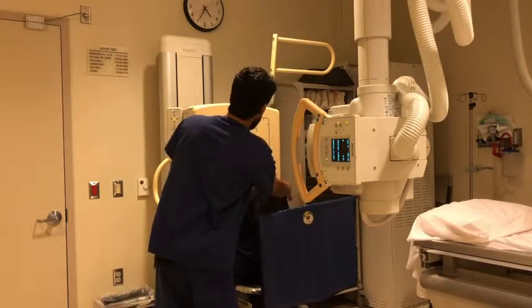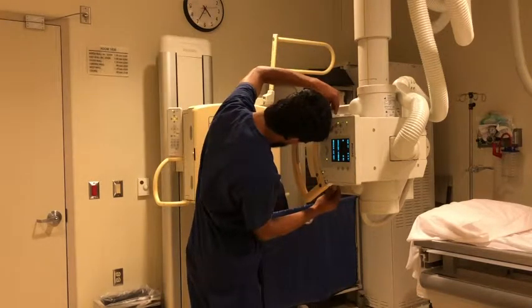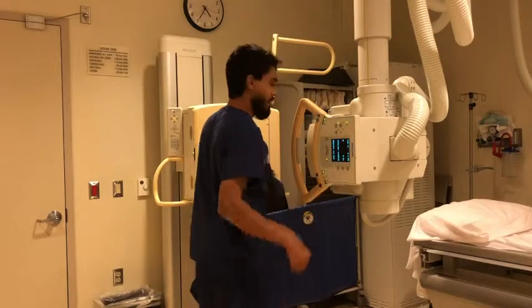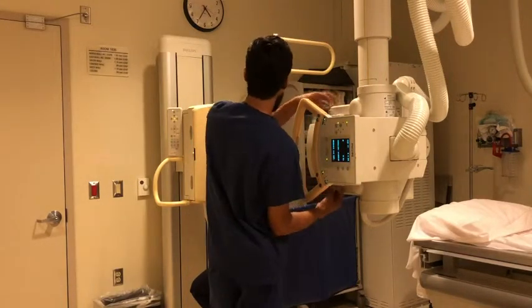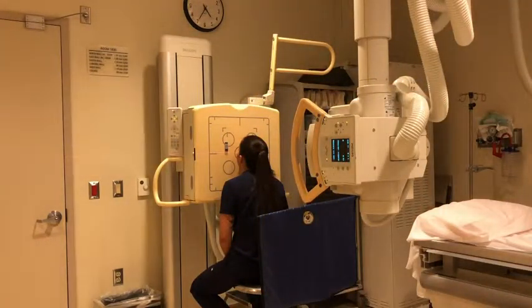A little bit. Alright, I'm going to make sure we got all the sinuses. Alright, let's go shoot the image. X-ray.